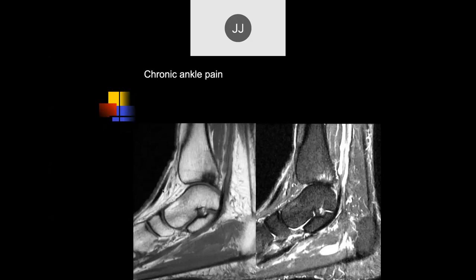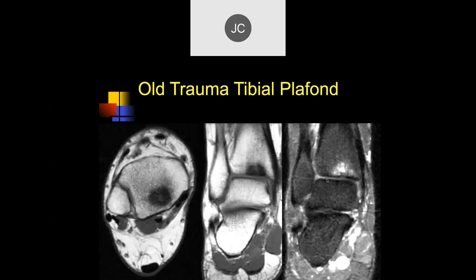Case: Chronic ankle pain. There is a lesion with very low signal intensity and fuzzy margins — typical of chronic disease — along with subchondral cyst formation. This is classic for chronic degenerative disease secondary to prior trauma, consistent with a chronic osteochondral injury of the tibial articular surface.